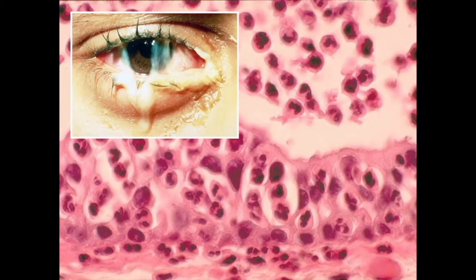The great majority of conjunctival disease is inflammatory and really doesn't make it to the laboratory. Here's an example of acute purulent conjunctivitis due to H. flu. The histopathology was an incidental section showing polymorphonuclear leukocytes comprising the exudate and infiltrating the epithelium.